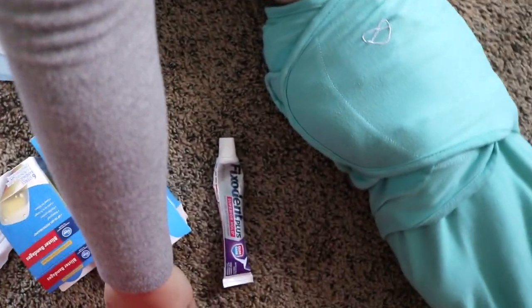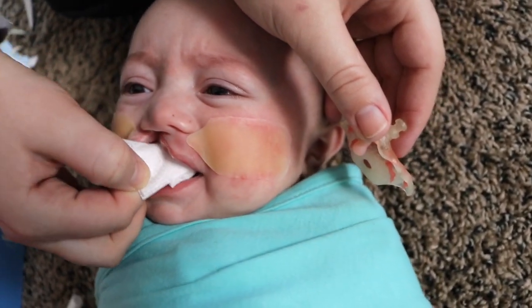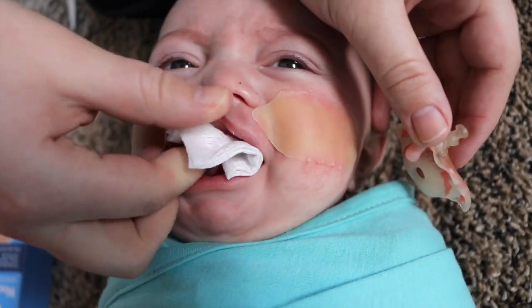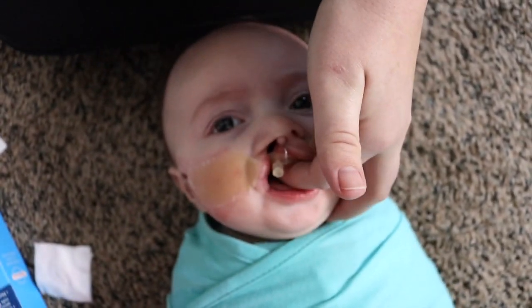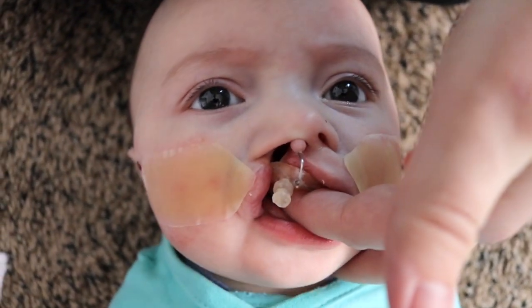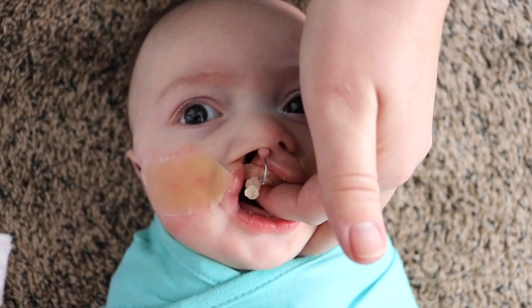Next I grab a piece of gauze and dry off his gum pads. If his gum pads are wet at all, the NAM isn't going to stick, so we have to make sure to get them nice and dry. He doesn't really like this part because he doesn't care to have my hand in his mouth, but it's not hurting him — he just doesn't enjoy it. Then I take the NAM and stick it underneath a piece of gauze so he doesn't get his gum pads wet again with his tongue. I fit it into place on his gum pads and make sure the nasal stent is in his nose. I hold it in place while the glue dries — he likes to suck on my finger during this part, which calms him down, and a lot of times he'll fall asleep.